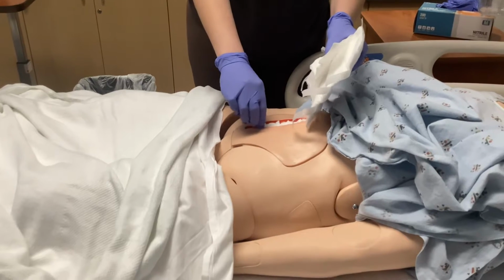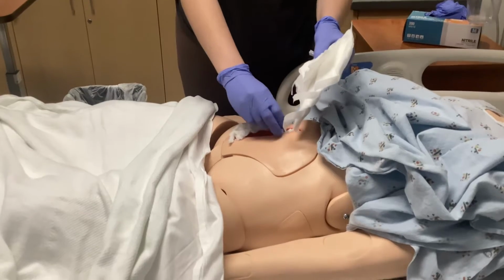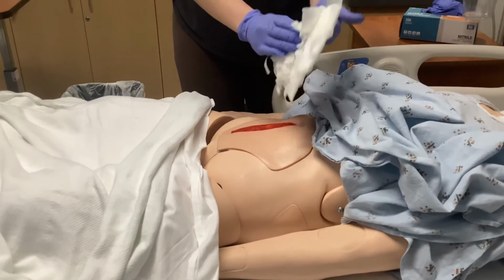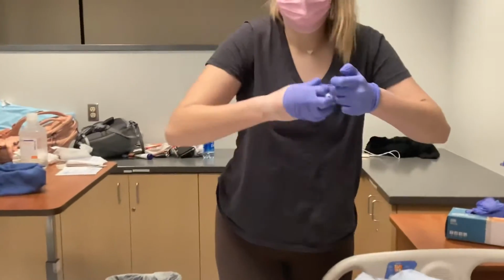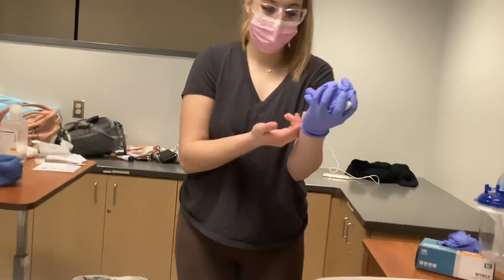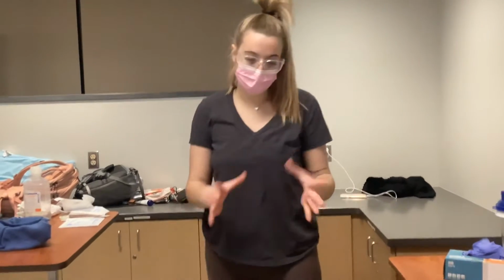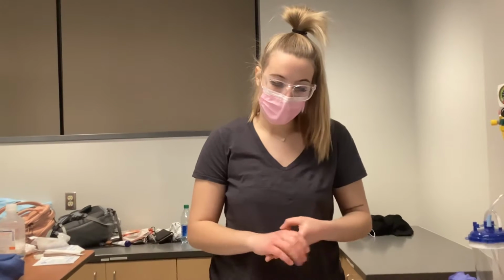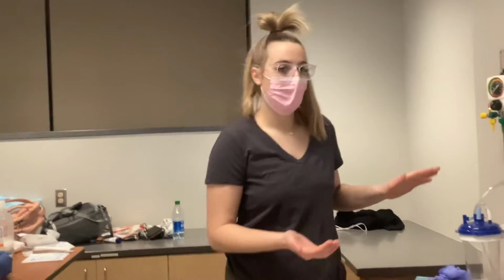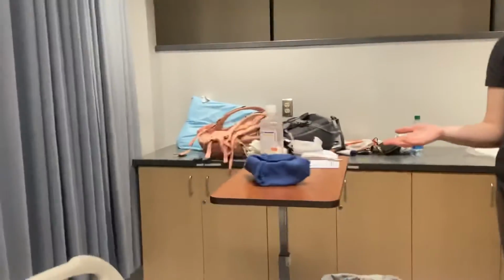All right, this is a wet to dry dressing, Mr. Jones. Keep breathing for me. All right, I would roll this into my gloves. At this time, I would assess the wound for any color, amount of drainage, odor, the width, the length, the depth. Okay, now I will wash and dry my hands, and during assessment I would have gotten my supplies needed.